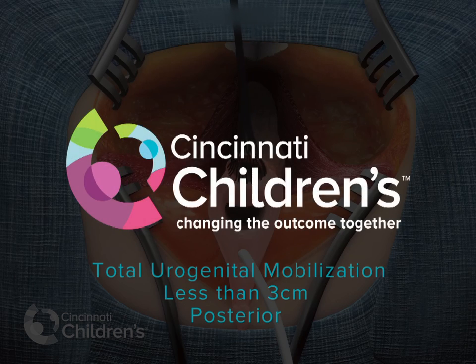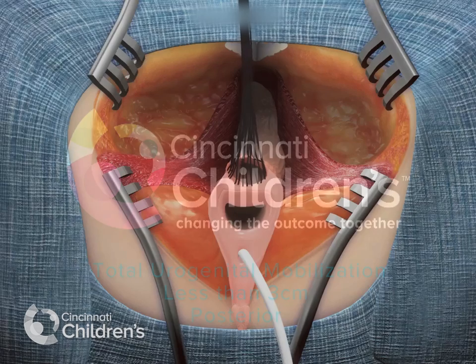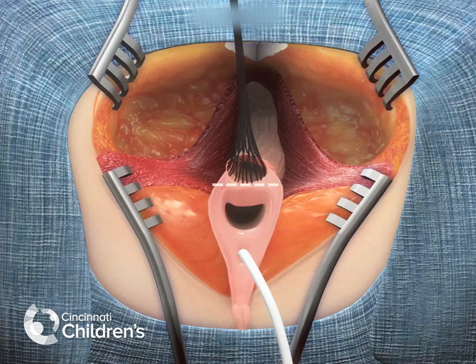Here we are watching a repair of a cloacal malformation with a common channel less than 3 cm.